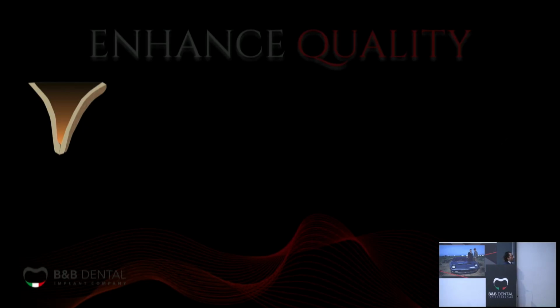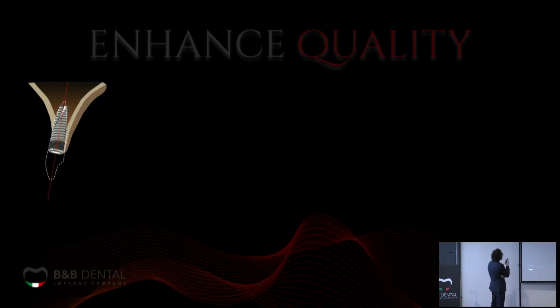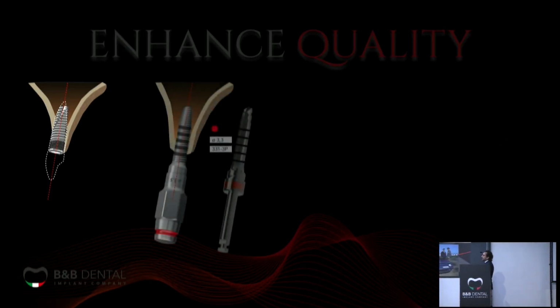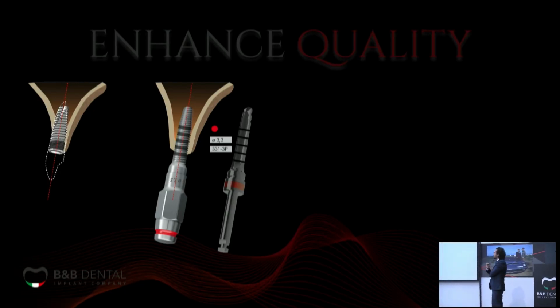So let's think about the biology. How can we enhance the quality of the bone, avoiding the use of GBR or biomaterials? And we know that if we want to insert an implant in a thin crest like the one that we have here, if we use screw-type expanders, bone expanders, we can avoid the use of drills, so we are not going to generate heat to the bone.